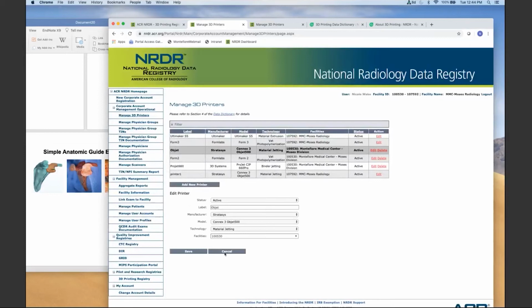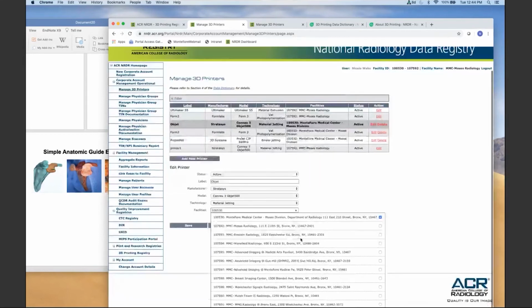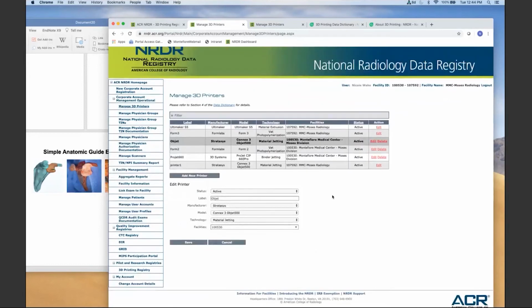And when you need to, you can access this Manage Printers interface. But typically, when you're entering the specific details for a particular case, you're just referencing this list through the name that you've assigned in that label column. So the very left-hand column in that table that says label, you saw how Nicole was referencing these printers through that label. So again, just the idea that you're referencing this table, but not really editing this table frequently.